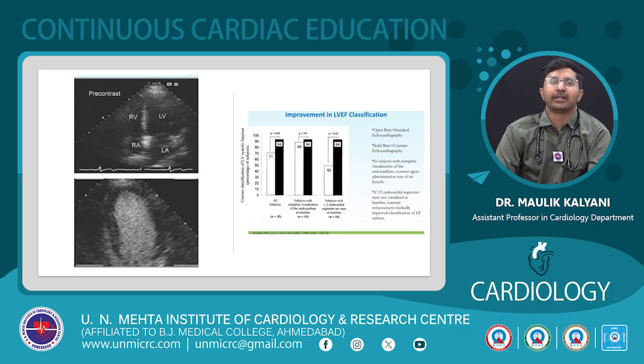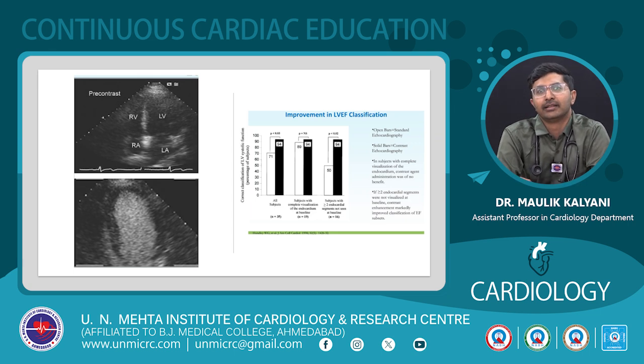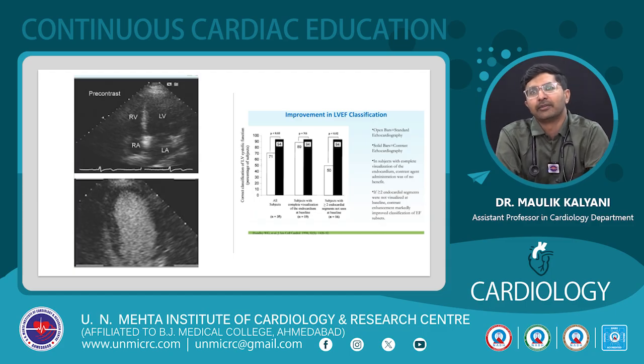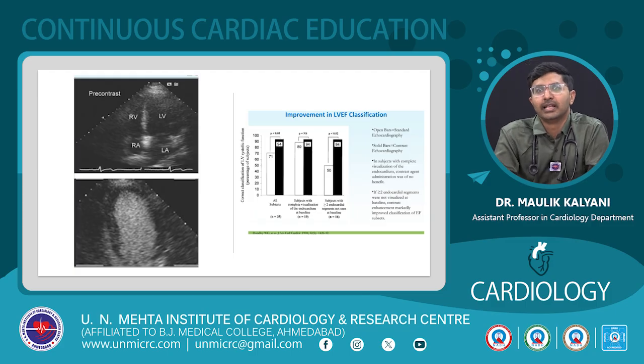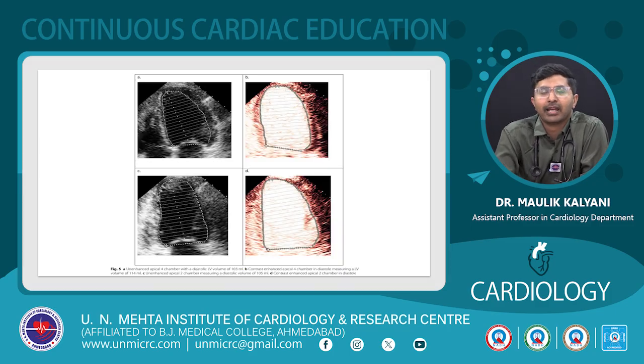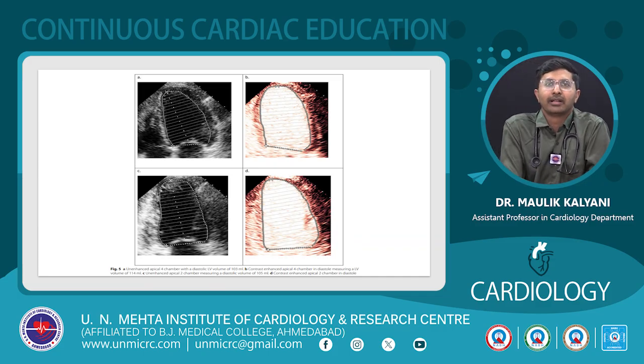In the lower image, after injecting the contrast, complete endocardial delineation is achieved. In the right-sided study, the difference between ejection fraction in contrast and non-contrast study is not much if fewer than 2 segments are missed and almost all segments are visualized. But if 2 or more segments are not visualized, then the difference in the EF is much higher. In those cases, we can use contrast to accurately delineate the endocardial border, and then apply Simpson's method.